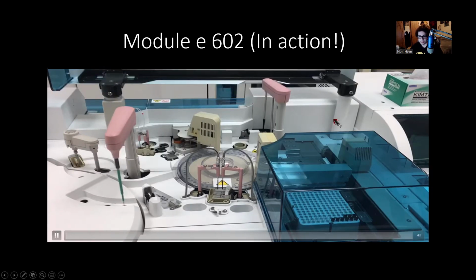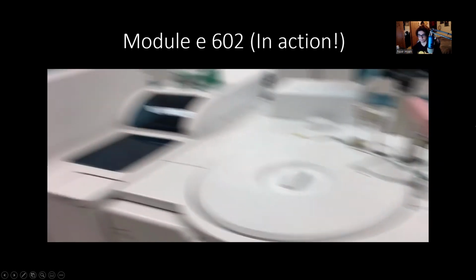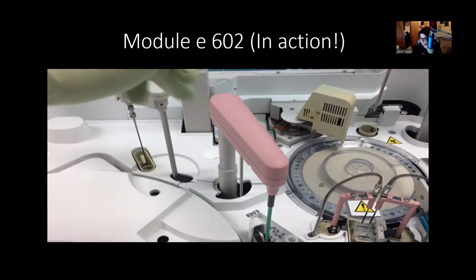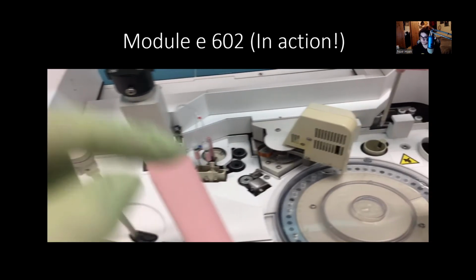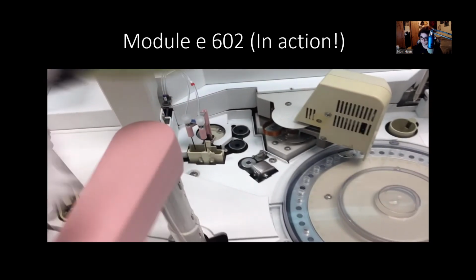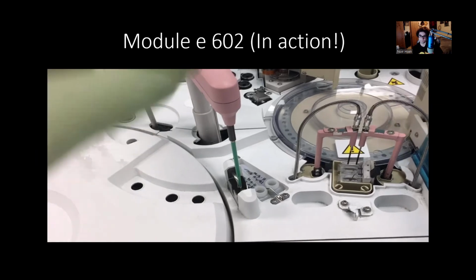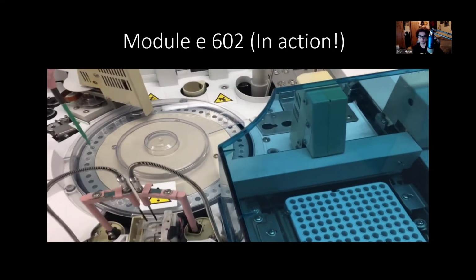And here's a little presentation. So this is the Cobas immunoassay module. There's obviously a lot of modules here, but this is the immunoassay module. This probe is the reagent probe, and this is the sample probe. This is the pre-separation, and this is the post. And as you see, the reagent's going in, and it's going into the wells with the samples, and it's being read right over there.